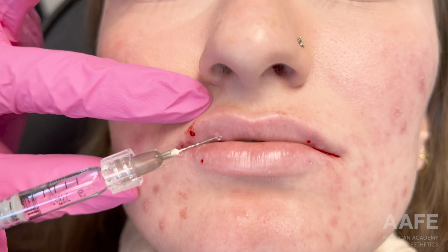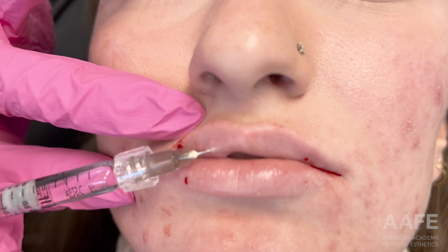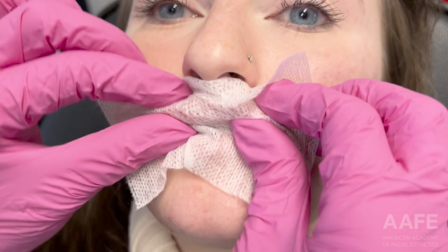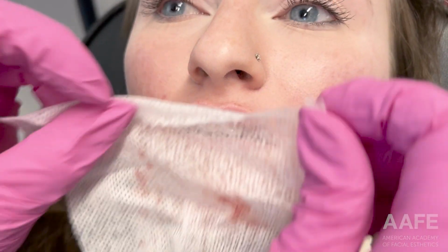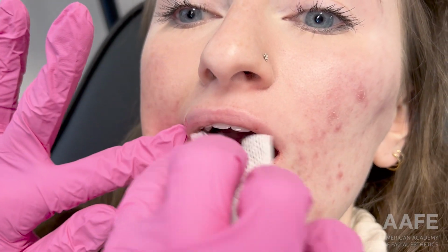You can see here a little bit of bleeding that is completely normal, and a little bit of asymmetry to start, so I'm going to go in and try to even that out. It may not be exactly perfect, but we want to get as symmetrical as possible. Using some gauze to manipulate that product, not too firmly. We don't want to deplete everything we just placed, but I do want it to integrate into the tissue and make sure it's not lumpy or bumpy, and that the product is sitting really nicely. So I'm palpating, feeling that product, and massaging it where I see necessary.